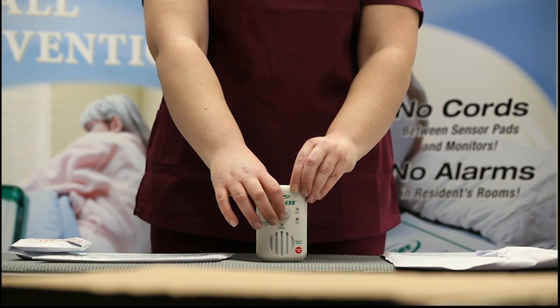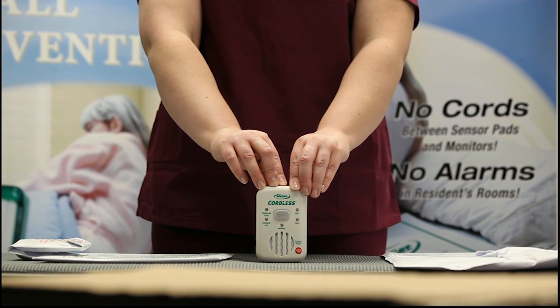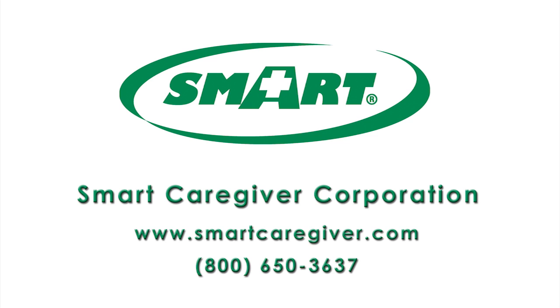Press reset. Test your pads at this time to make sure everything is working correctly. Take a look at the first pad.